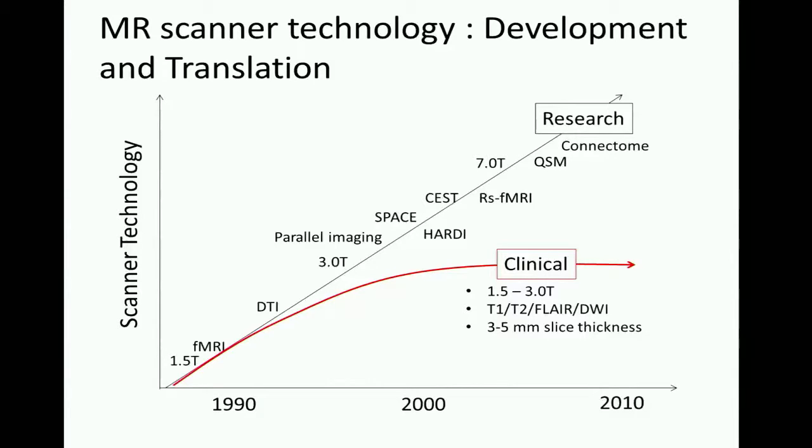But then they said, okay, that's fine, but from a macroscopic point of view, more than 10% fewer patients can receive the MRI. The downside is tangible and imminent, and what can I give to them? And I said, well, volume-based numbers of the brain volumes or structure volumes, and they said, okay, come back later. So that has been one of the difficulties.